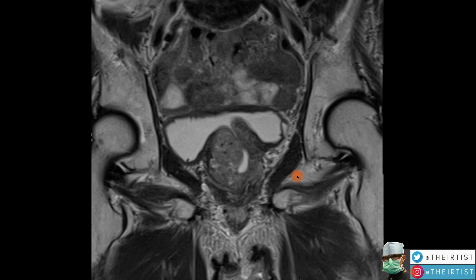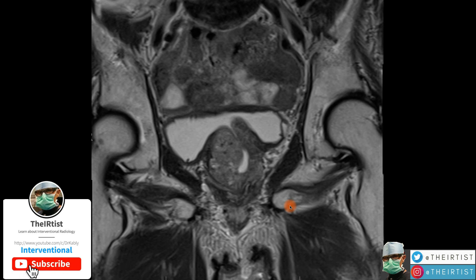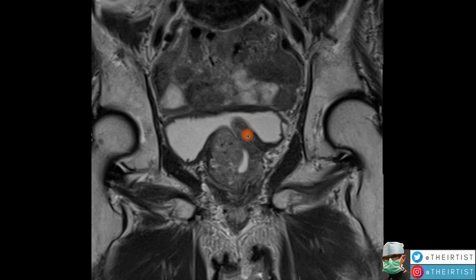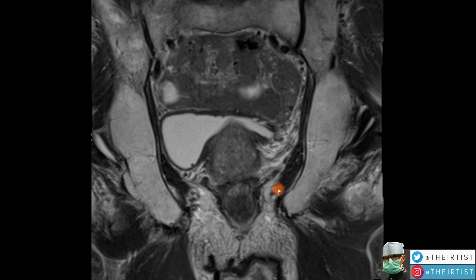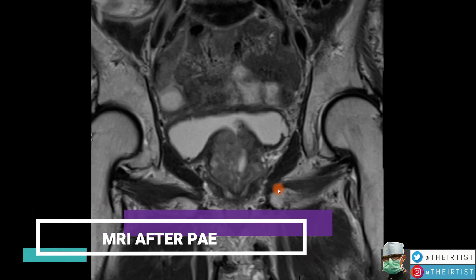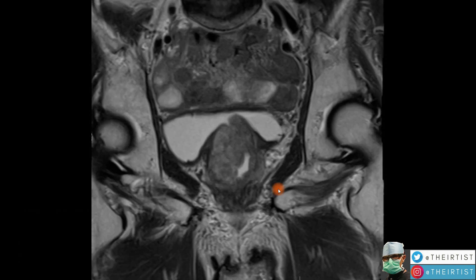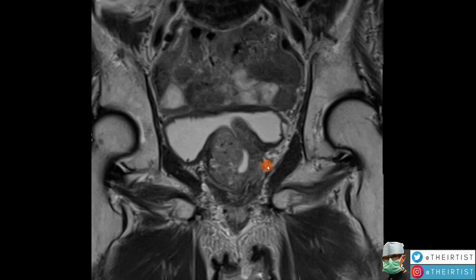This is a frontal MRI view of the prostate, the same orientation as before, taken a few months after PAE. We were only able to treat the left lobe. What's left of the left lobe shows what we call atrophy — meaning shrinkage, smaller volume, smaller size. Now look at the right lobe of the prostate.